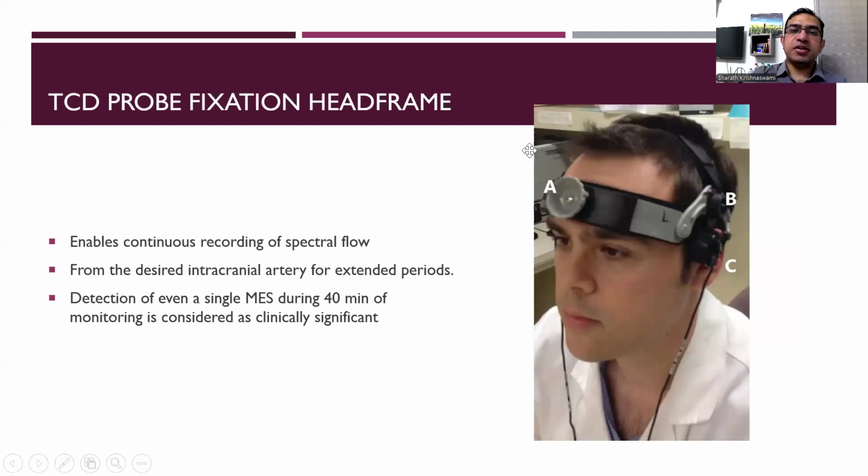This is the head frame that I was talking about, which enables a continuous recording of the spectral flow in one particular intracranial artery for extended periods of time. And detection of even a single microembolic signal during 40 minutes of monitoring is considered clinically significant.